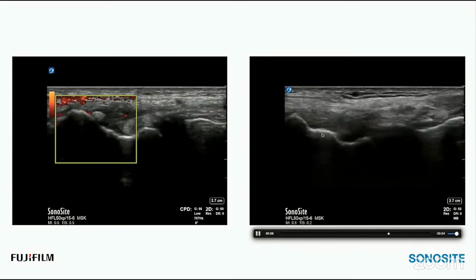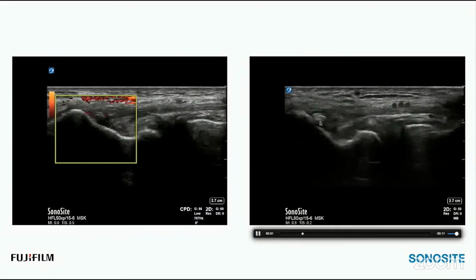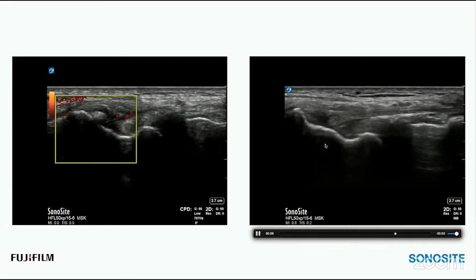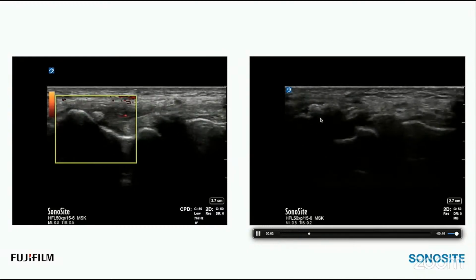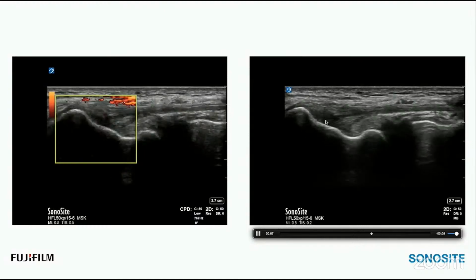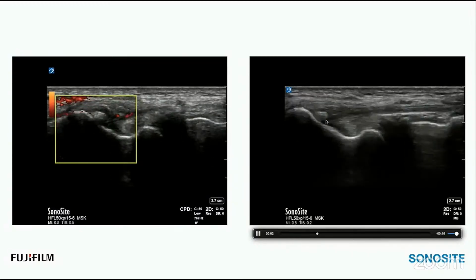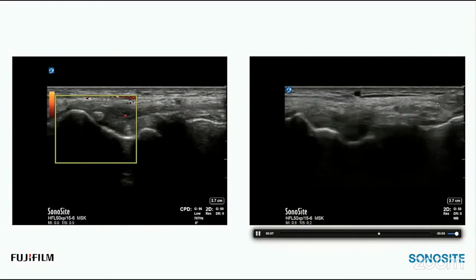But some of these other parts right here that are not shadowing, say this was a patient that presented only with that bright hyperechoic structure in the tendon that did not shadow, you want to watch out for those because they're not quite going to show up on a radiograph if they're not shadowing. So they're not dense enough to cast a shadow. On ultrasound, you're catching calcium at an early enough phase that it could possibly be lavaged and aspirated. So looking into your clinical toolbox, using all the tools you can, ultrasound is a great one to decide, hey, could you chase down a calcium deposit early and get it out of there.